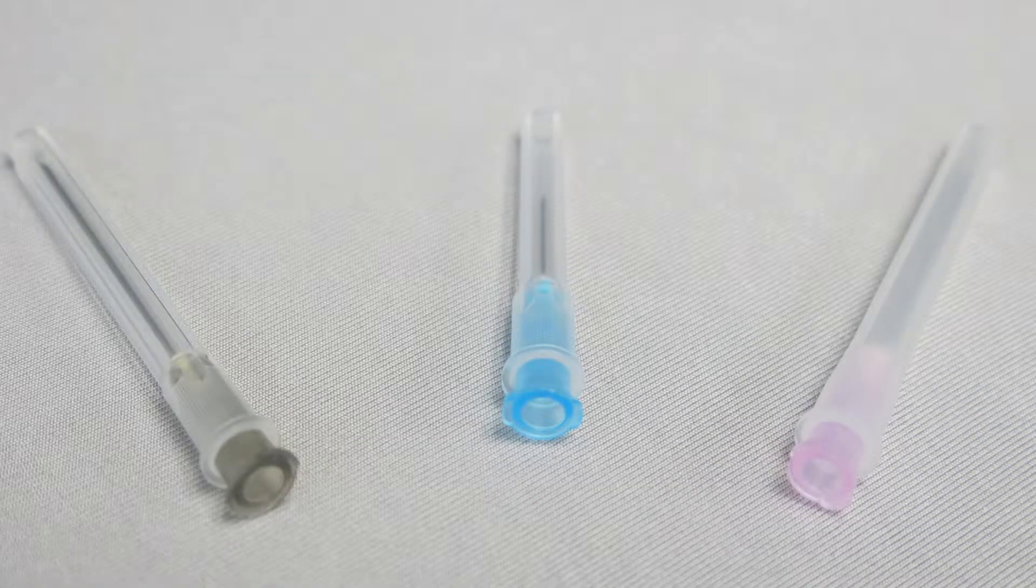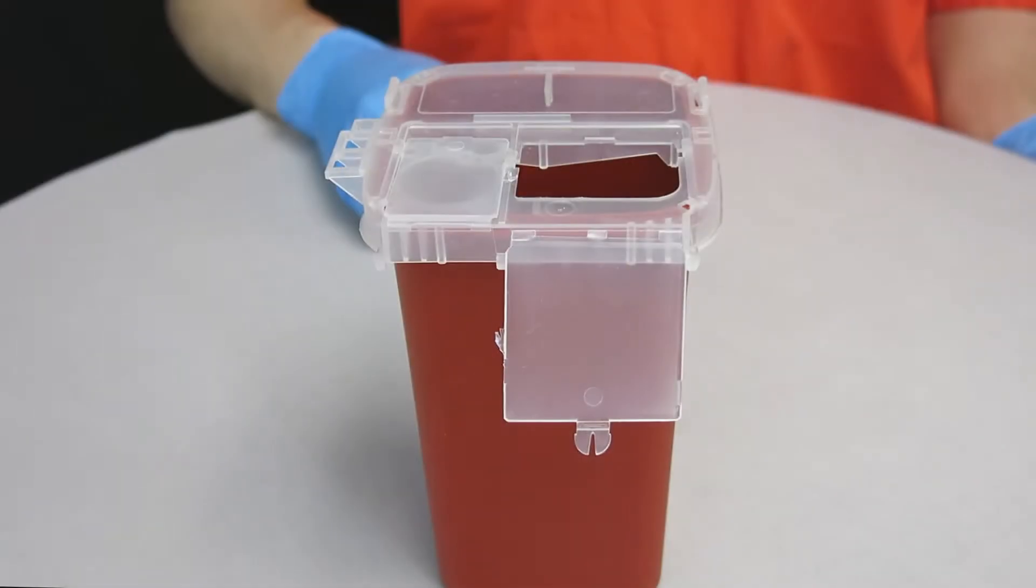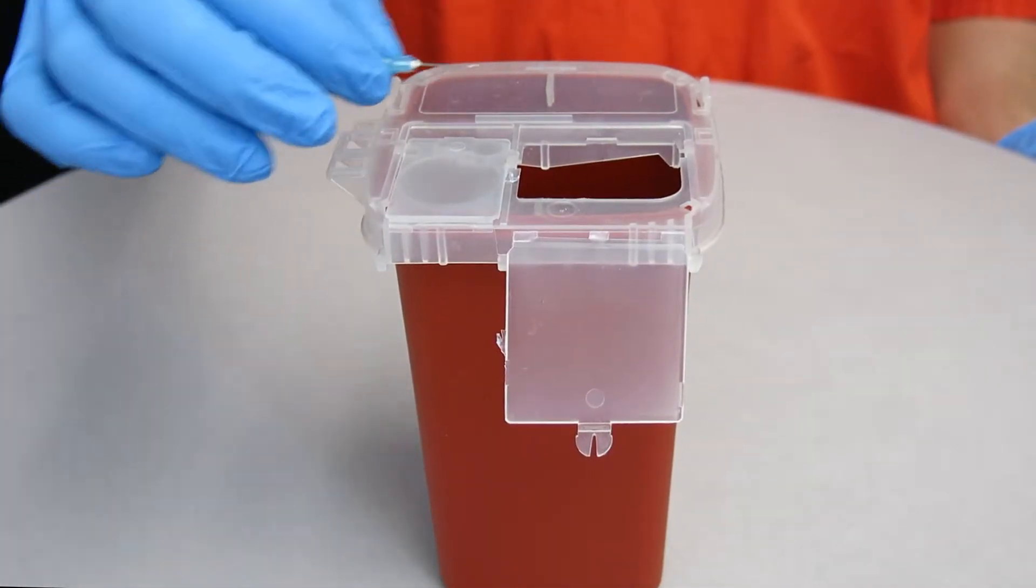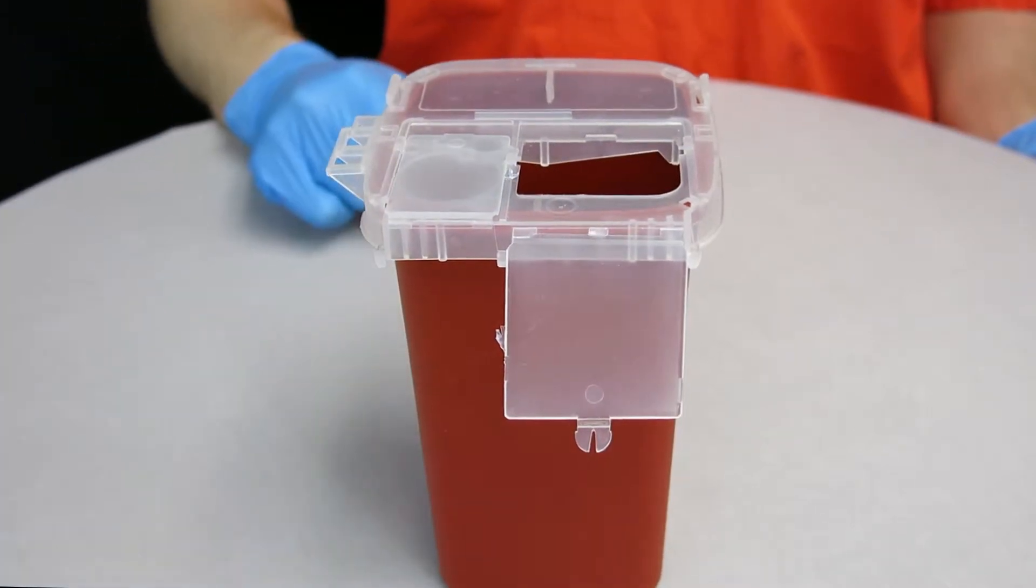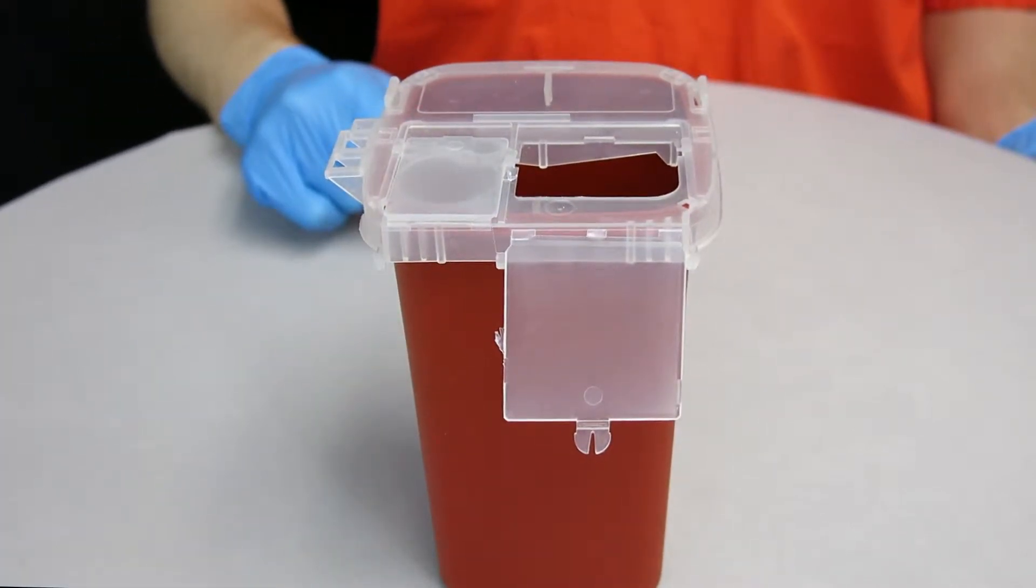Make certain that the correct size of sharp is selected for the rodent and the sampling site according to your facility's policies and protocols. Use a new sharp for each rodent or when you are unsure of the sharp's sterility. Do not recap a sharp and be sure to dispose of sharps according to your facility's policies and protocols.